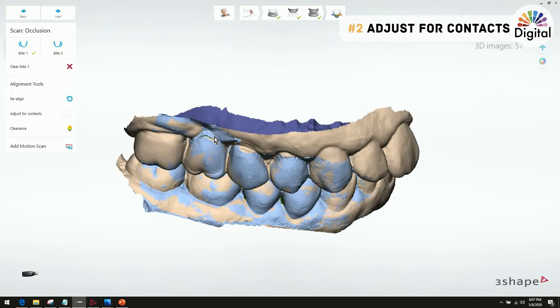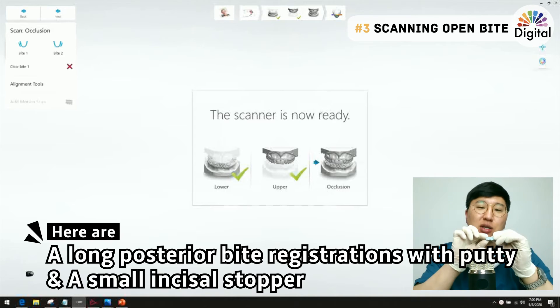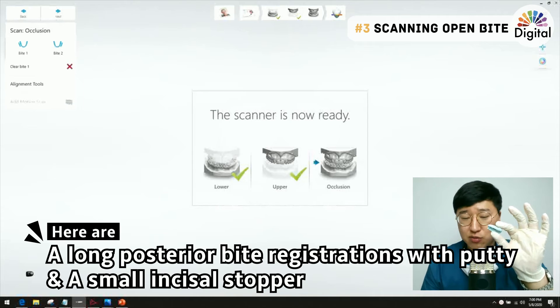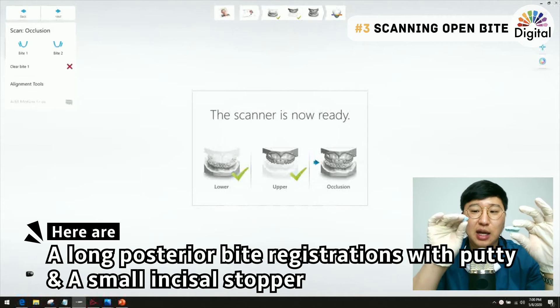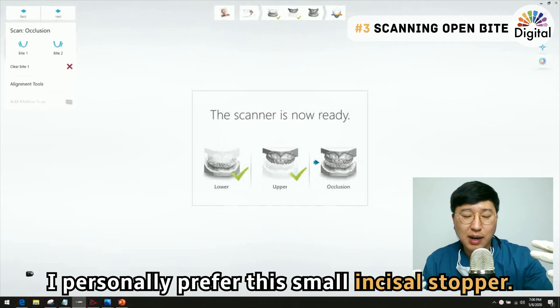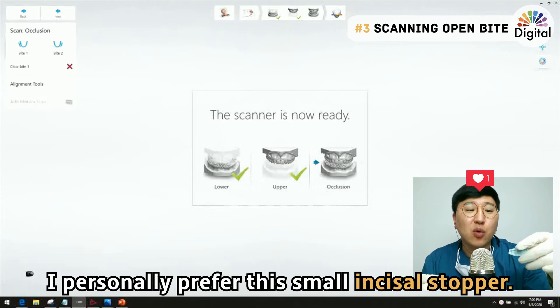The third tip today is about the bite scan when we need to open the bite. I have a longer posterior bite registration with putty, and I also have a small anterior stopper. Which one is better? My answer is: I like the small anterior stopper better. Let me show you why.